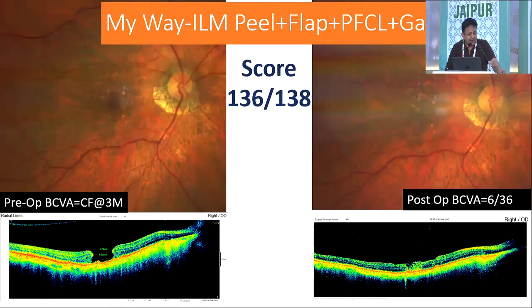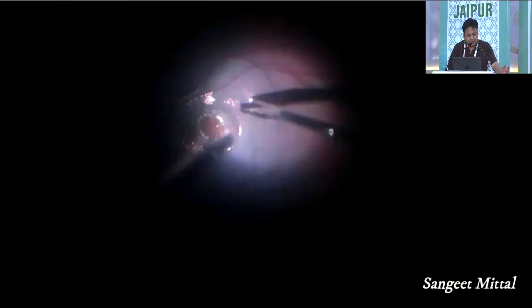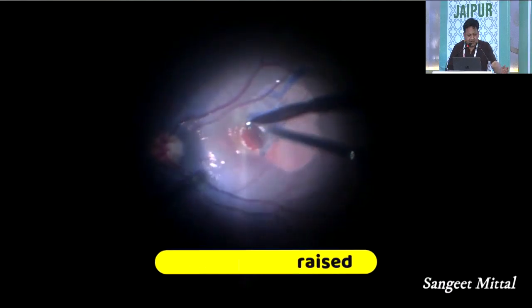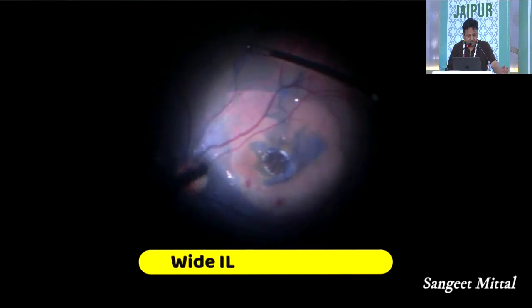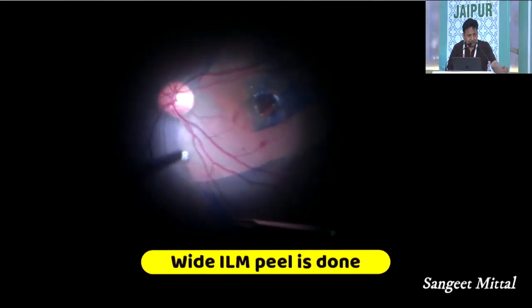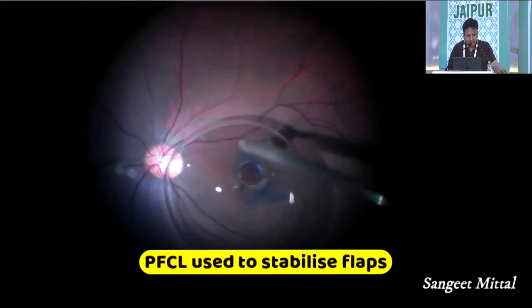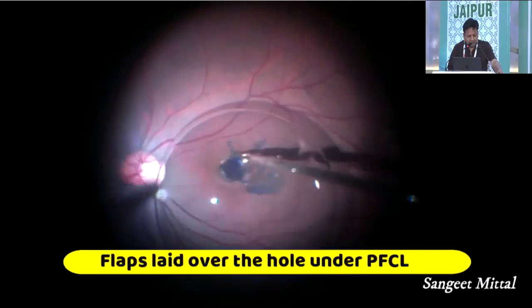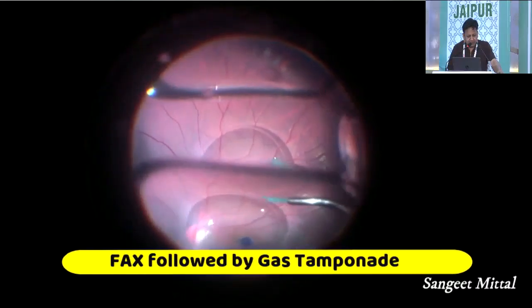But suddenly, I was very happy doing this, like in this patient with a giant macular hole. I followed the same procedure, followed by a gas tamponade.